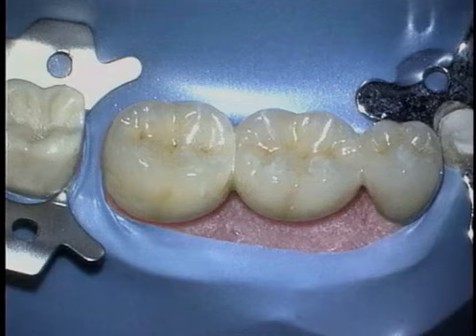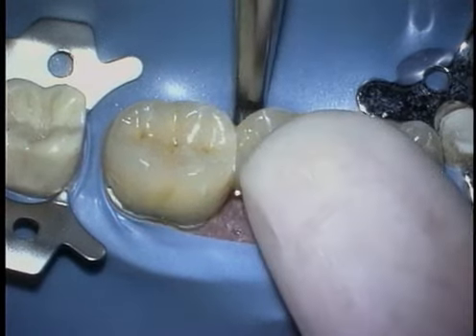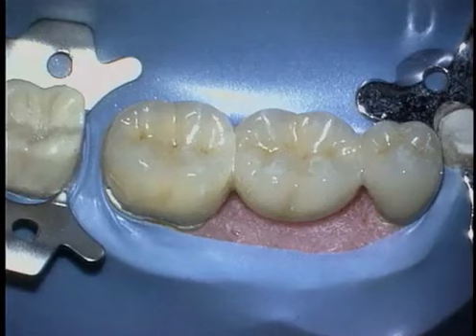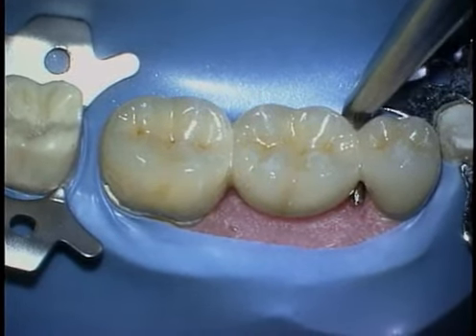In the clinical situation, the appropriate tip is placed just mesial to the posterior abutment. The finger is applied for safety. It is important to apply steady pressure with the device on the engaged restorative while activating the trigger.